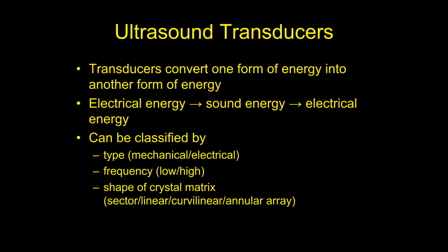Okay, so for the purposes of ultrasound, the transducer that you hold in your hand takes electrical energy out of the ultrasound machine from the wall socket, and it converts that electrical energy into sound energy, sends that sound energy into the body.